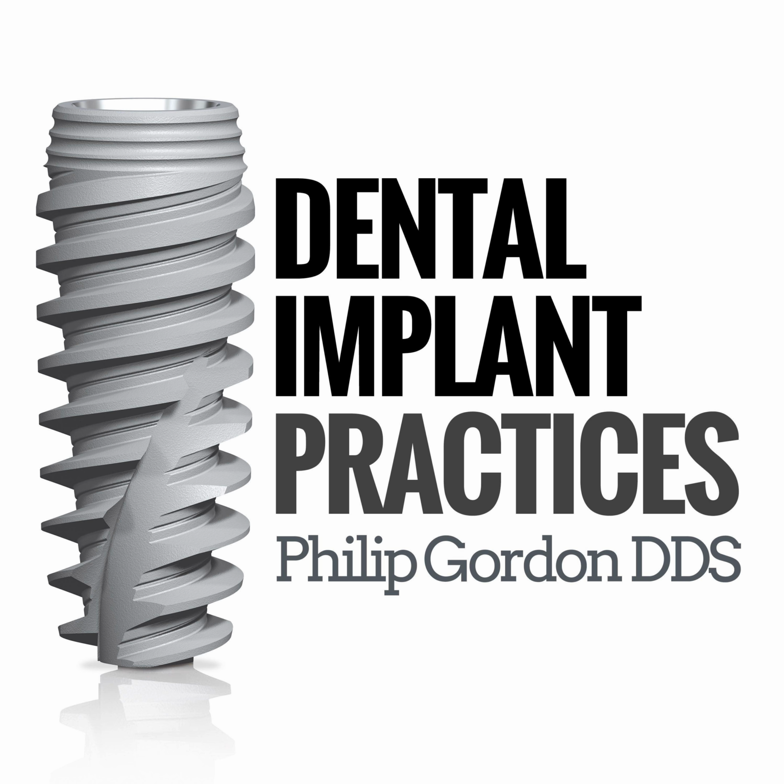So things to think about: you're looking for a high degree of primary stability in a lot of these situations, because with implants like this, you're sometimes looking at immediate placement and restoration, or immediate placement temporization. So those aggressive threads allow the primary stability that you're looking for, typically above 35 Newton centimeters, to be able to temporize or engage somehow.